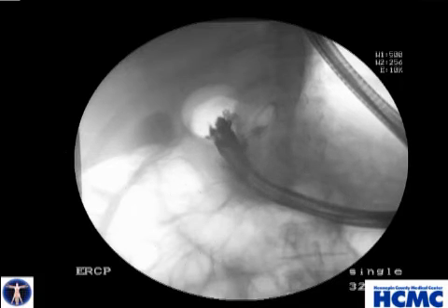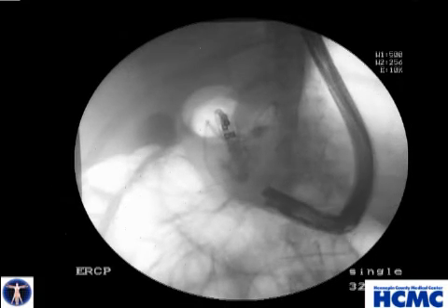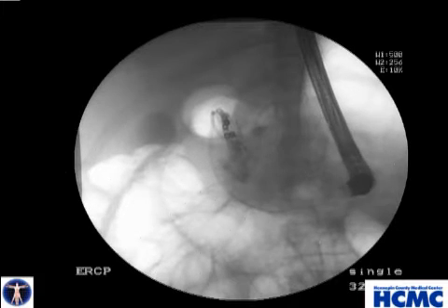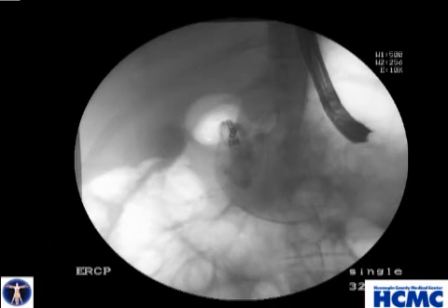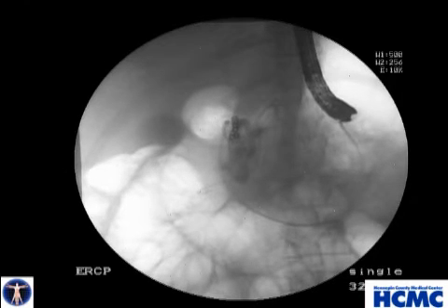Also we're placing a nasocystic drain into the cavity and reposition it out the nose, and this is in order to vigorously lavage the cavity for a couple of days with saline. Then the patient's discharged and the nasocystic drain removed.